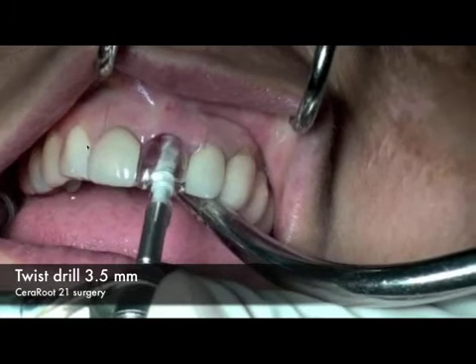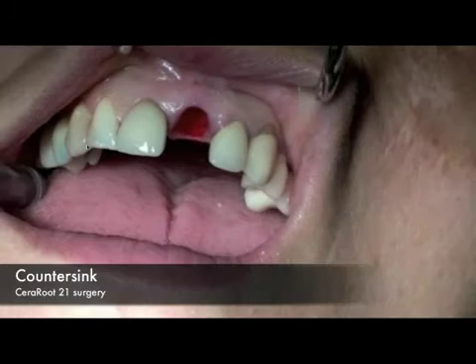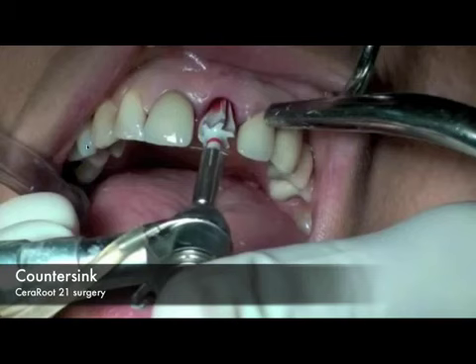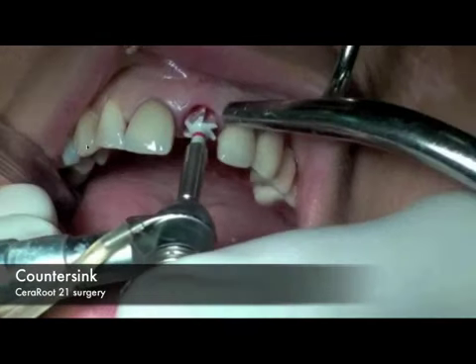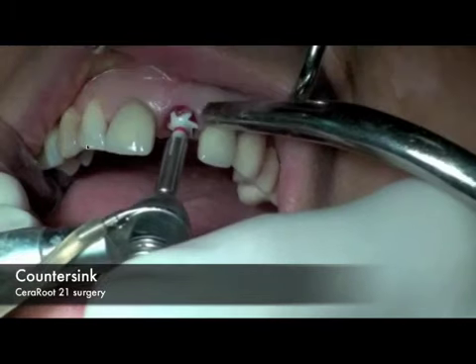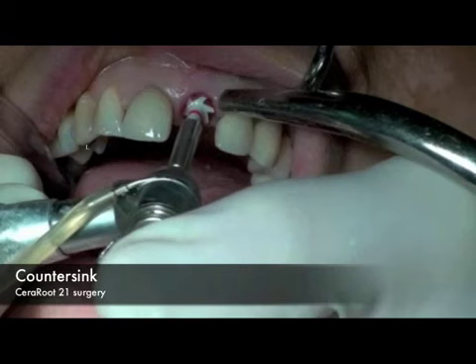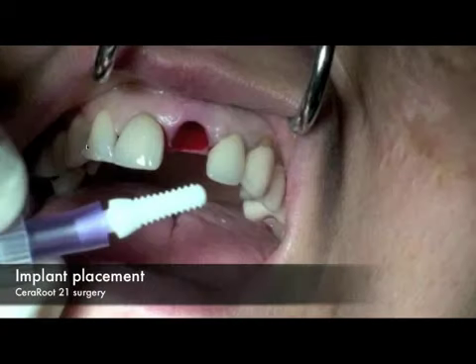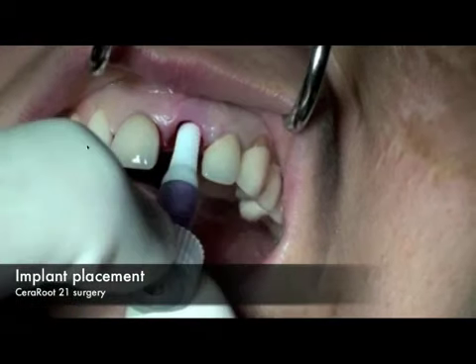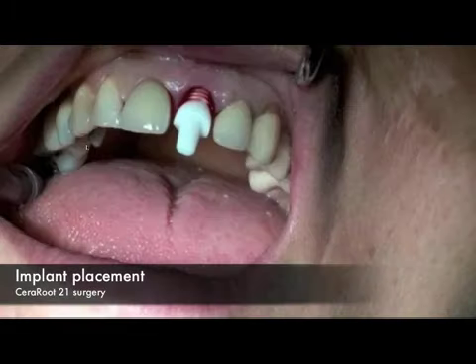And we're done with the 3.5 millimeter, and we're going to now advance to the countersink and give us the emergence profile of the tooth. And at this point, we're essentially done with the osteotomy, and we're ready to introduce the implant into place. Again, we have the silicone carrier that's used to initially thread the implant. At some point, once we reach a certain torque, it bottoms out, and we switch to the torque wrench.